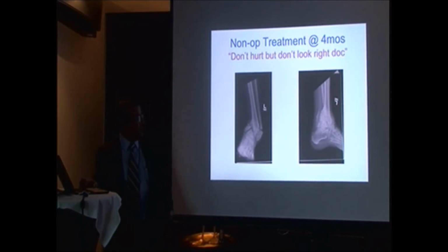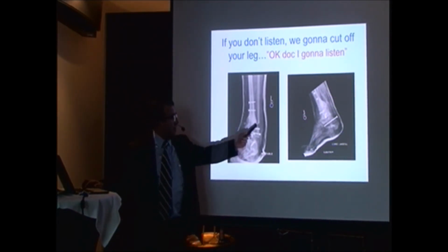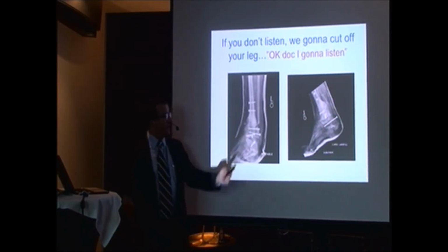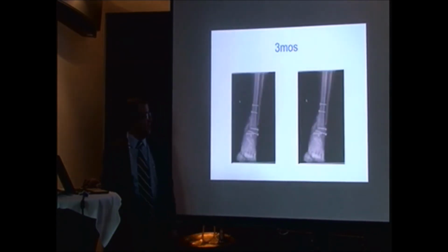So obviously, there's no choice but to do an arthrodesis. So we go in and do an arthrodesis. My technique is I like the lateral approach. I use the fibula as an autograft. So we put the nail, make a cut, autograft, a little bit of bone graft. This time he says, doctor, I will listen to you. And he comes back in 6 weeks, and you can see that he's beginning to heal. And at 3 months, I let him walk, and he went on to heal. Fortunately, he's very happy. Now he has his leg. He can smoke and eat all his candy now.